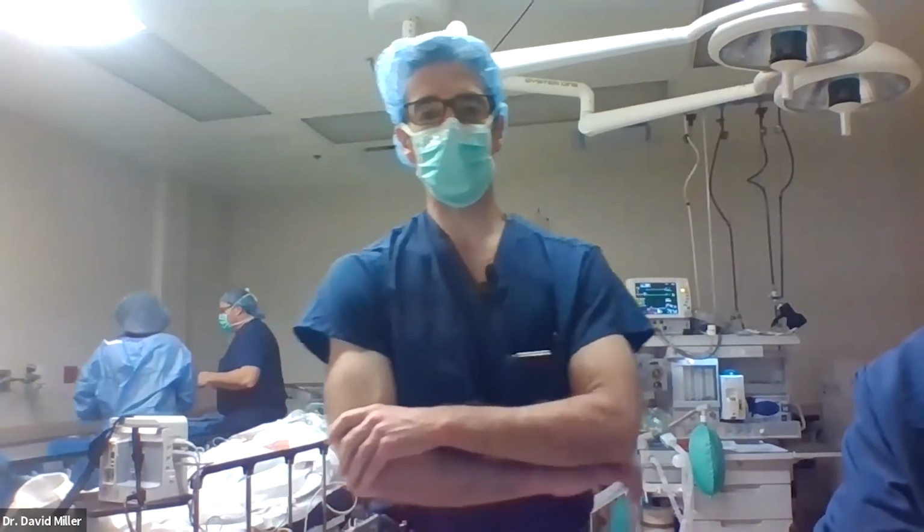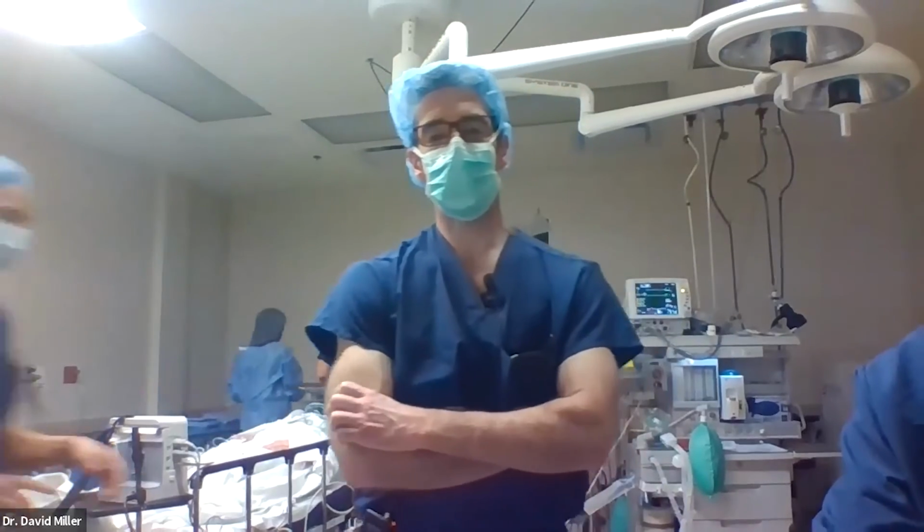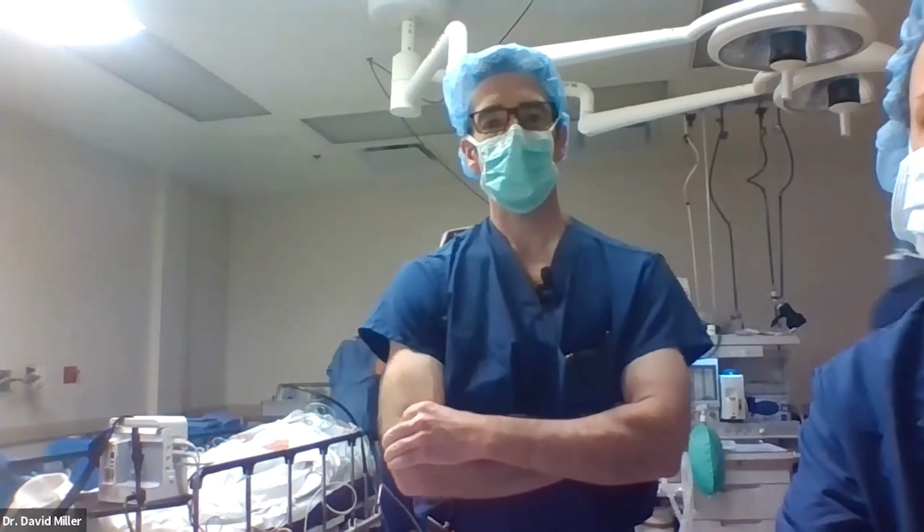So we're going to go back to the questions and answers and see what we got here. So do you find utility pre-op performing scleral depression to properly identify the breaks, or you can do it with the indirect ophthalmoscope first?